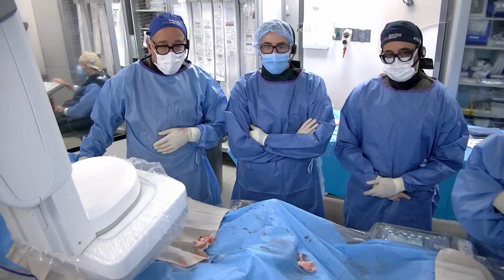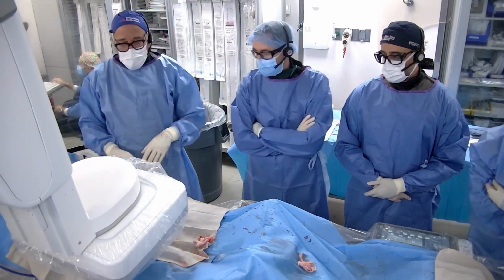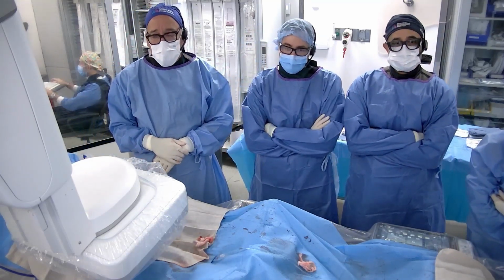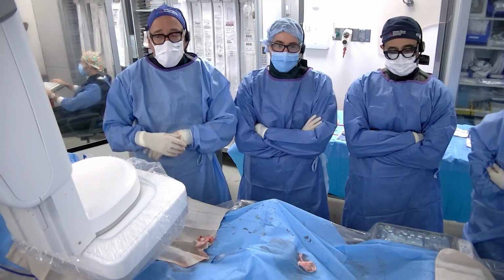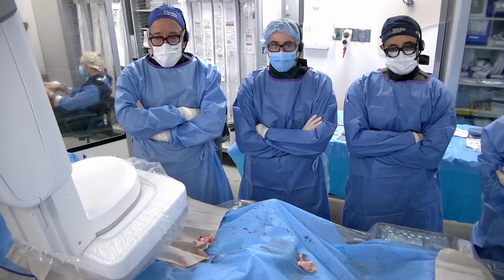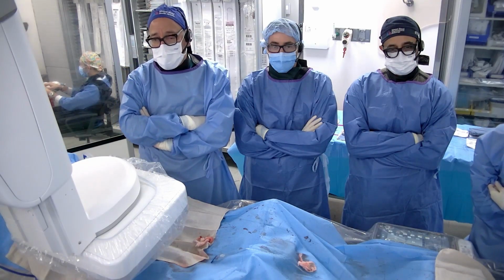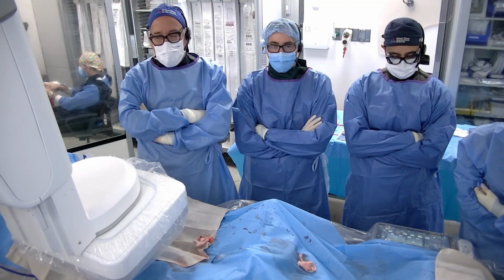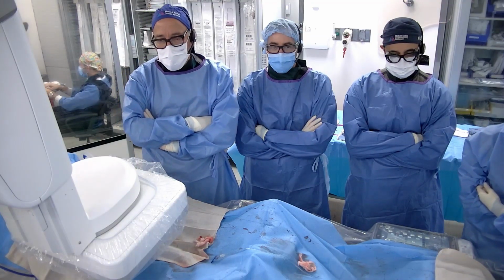And what about for the fem-pop, Rob? What are you guys thinking? So again, I'm curious as to what the panel thinks. I think there was a lot of recoil, and there's a little bit of calcification there. I'm probably, just to forecast this, inclined to putting at least one stent at the origin, likely to deal with that recoil that we saw up there. I think there's an opportunity for DCB distally, so we don't have a full metal jacket. I don't think I'm getting out of this case without putting at least one scaffold, probably in the proximal portion of the SFA.